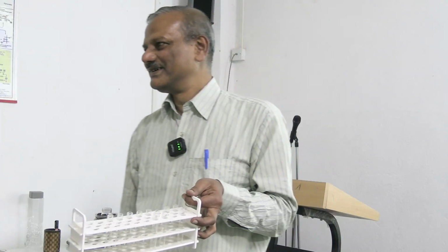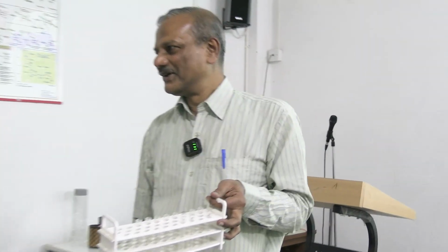Now, if you want to do it subsequently, you have to be very careful, because by chance if the tip touches the sample and you dispense it, it will contaminate the entire reagent. Do you get my point? That is the reason I am telling you to dispense the reagent first, so that you don't cause any contamination, and then you add the sample.